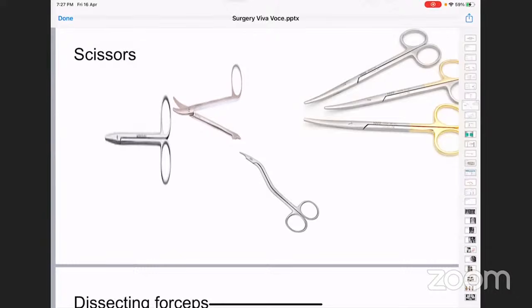Once you incise the fibers along their length, you lift both the tips, and then you cut the external oblique aponeurosis along the length of the fibers. For this step, we use the McIndoe scissors.